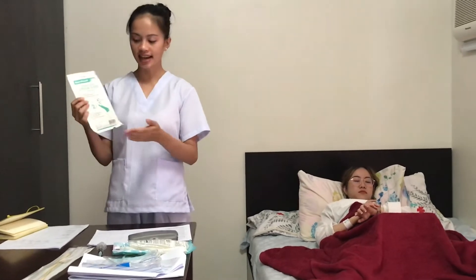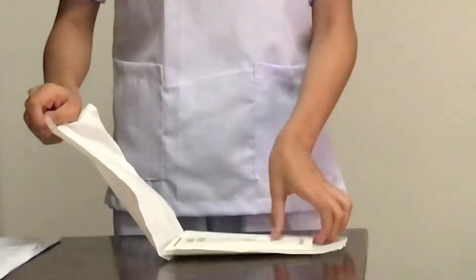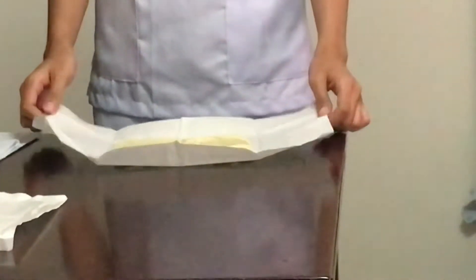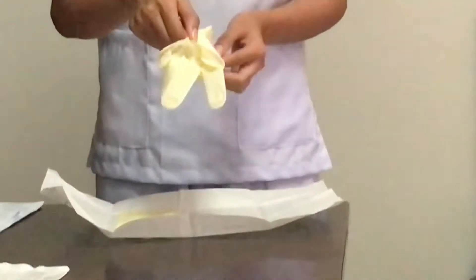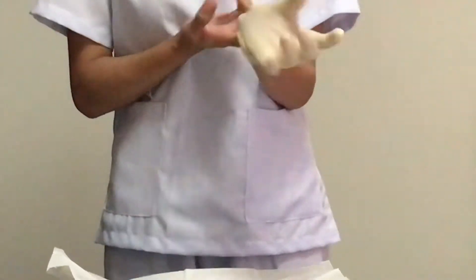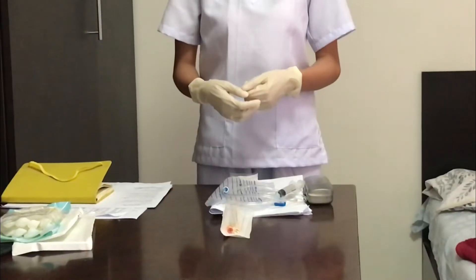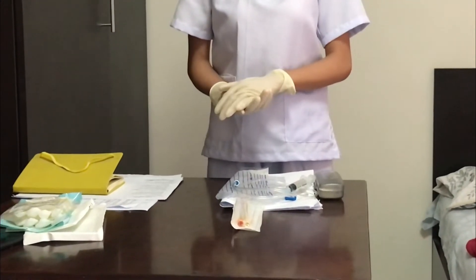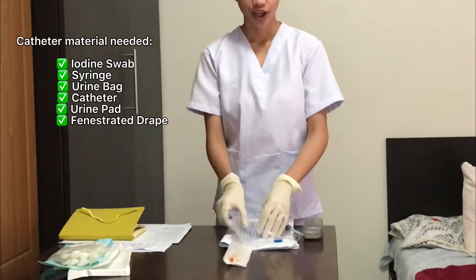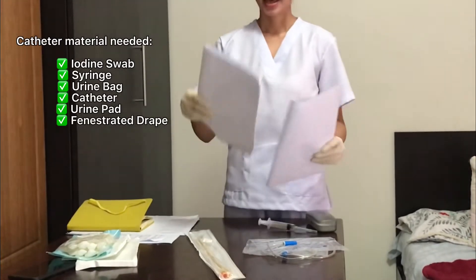This is my sterile gloves, a size of 7. Next is to open the sterile catheterization kit and position the patient. In the catheter kit, here is the iodine swab, the syringe, urine bag, catheter, urine pad, and fenestrated drape.